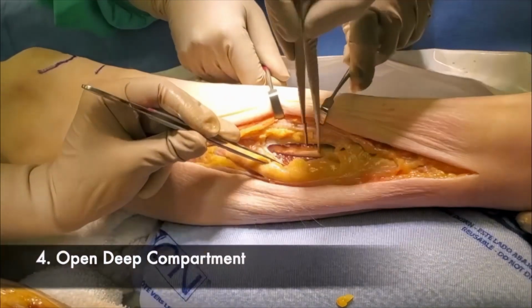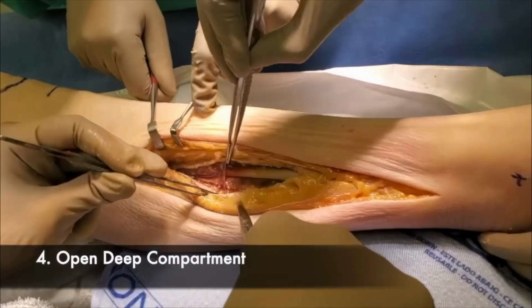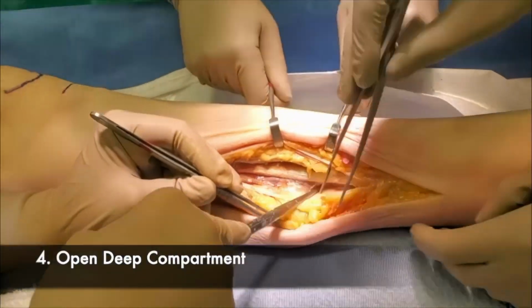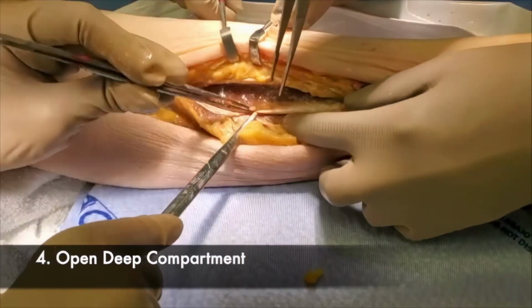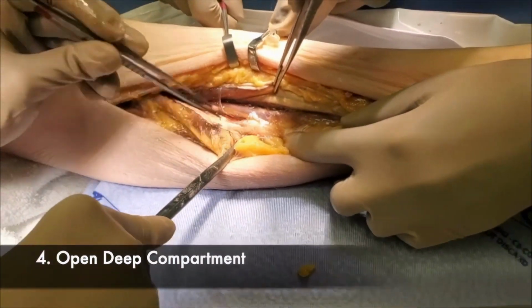Note that the deep compartment can sometimes be confused for the pocket between the soleus and gastrocnemius muscle. Identification and visualization of the posterior tibial neurovascular bundle will confirm entry into the deep leg compartment. Make sure all leg compartments are open along the full length of your long skin incision to prevent the skin or fascia from acting as a constrictor band.